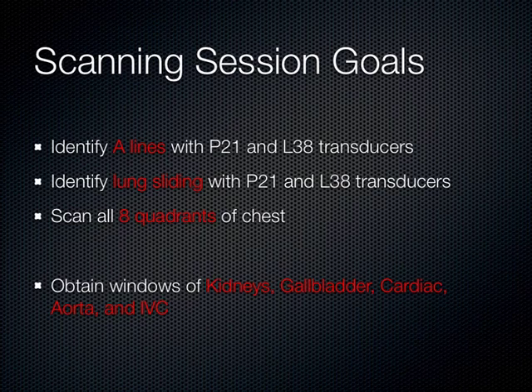And then with whatever time, do it also with a P21 probe. The P21 probe is a cardiac probe. You can see deeper. And the pleural line's going to be way at the top of the screen, so it's not going to give you the detail, but it gives you also an idea of whether any B lines are better seen with the P21 probe. So go back and forth between probes, but pneumothorax, you definitely want to use the high frequency probe.